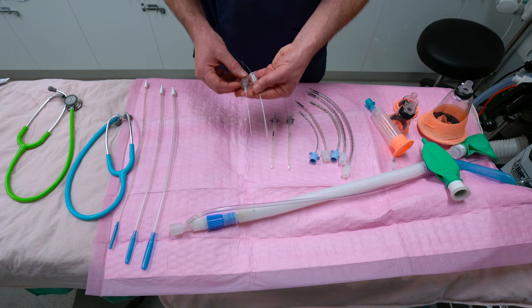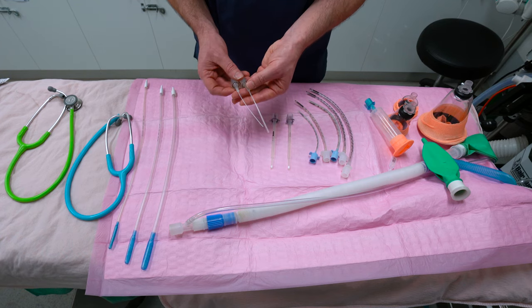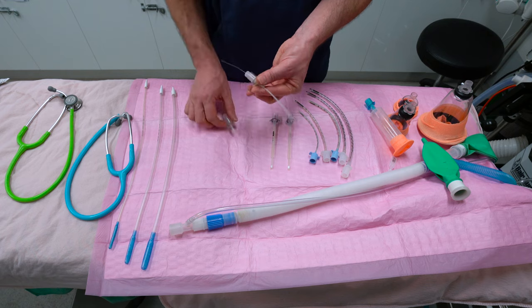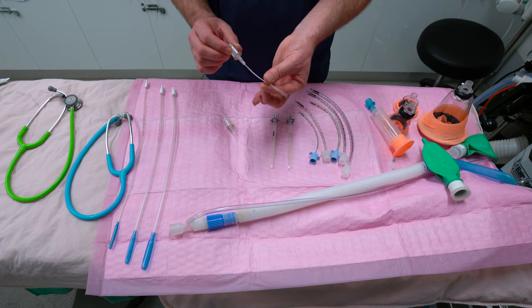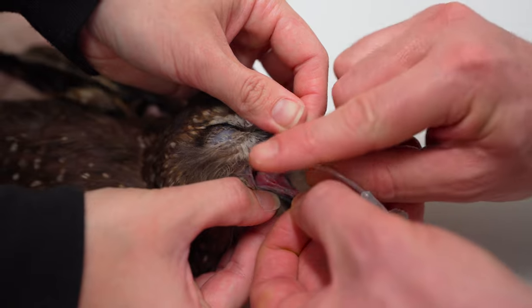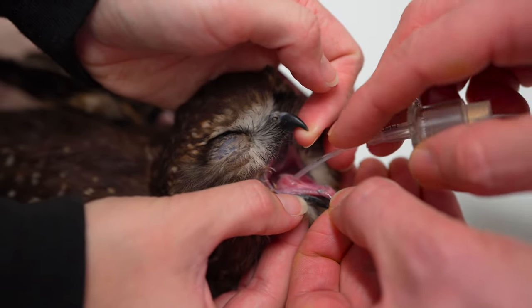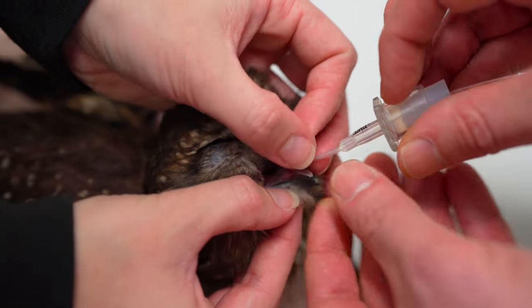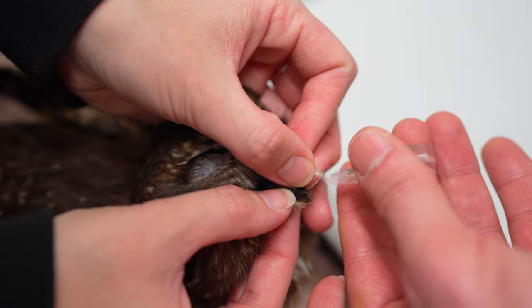For smaller birds, we have silicone tubes that are even smaller and have a guide inside to make them a little more rigid. Once you introduce the tube into the trachea, you can remove the guide and connect to the anesthetic machine.